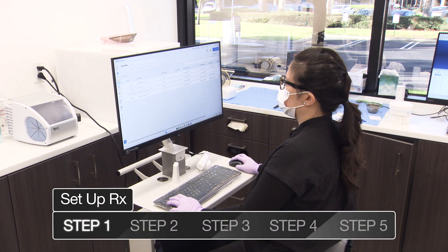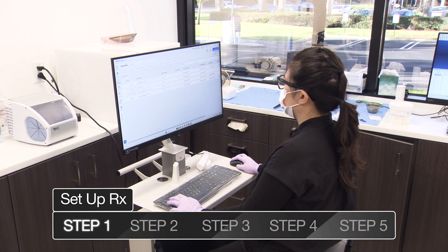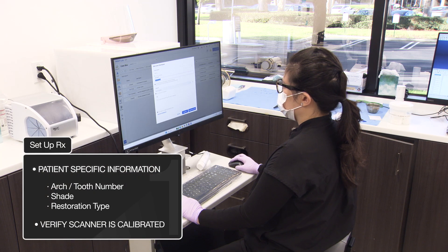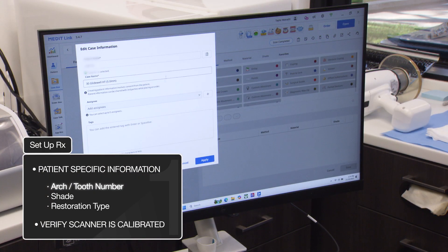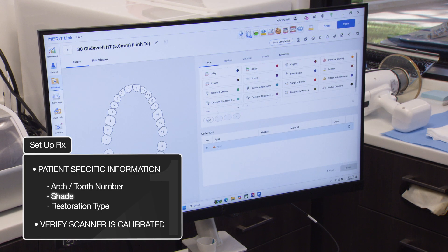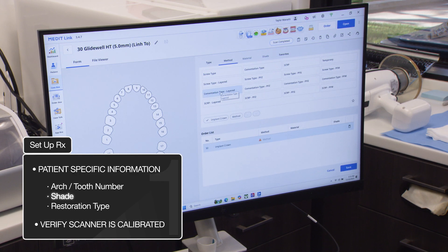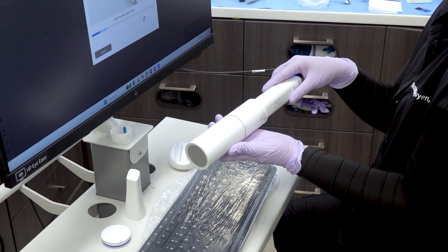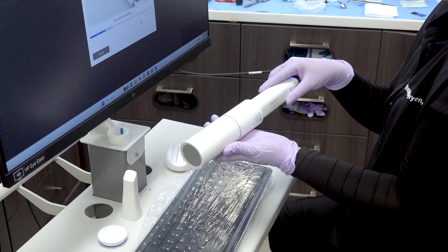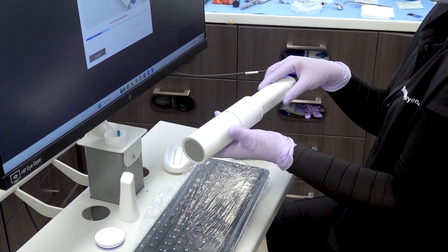We're going to start by creating a new case in your scanning software. Enter the patient's name and case ID information, then select the correct arch, tooth number, shade if taken already, and restoration type. Take a moment to verify that the scanner is calibrated and ready for use. Routine calibration helps maintain consistent accuracy and avoids alignment issues.